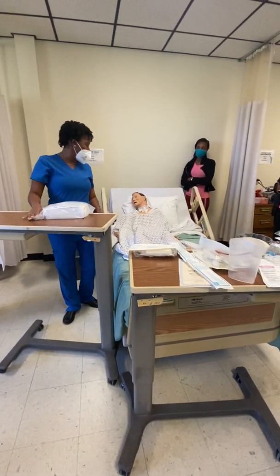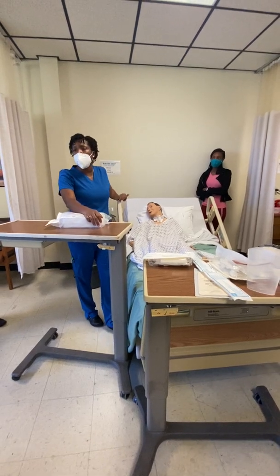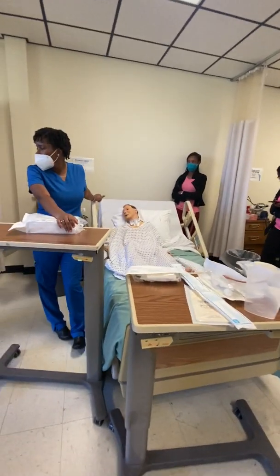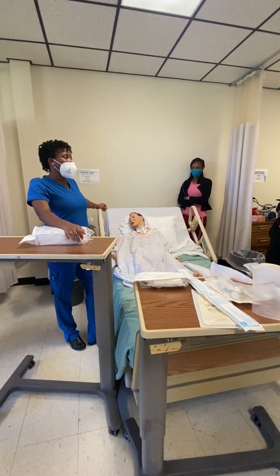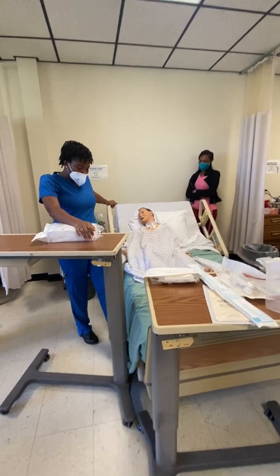Inspect it. What are we inspecting for? Expiration date, no holes. What else? It's all intact, no wetness. Everything. Allergies.